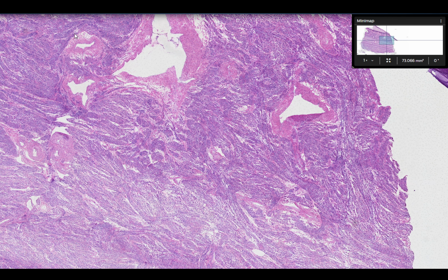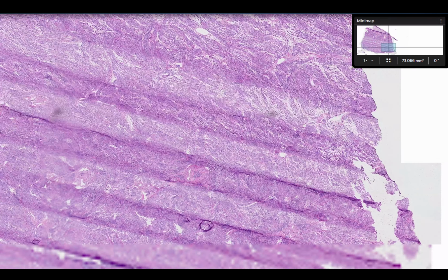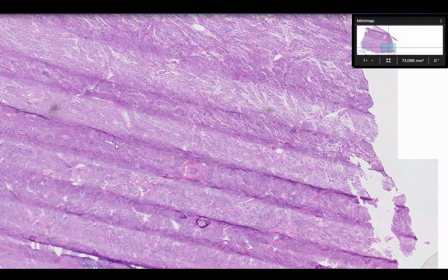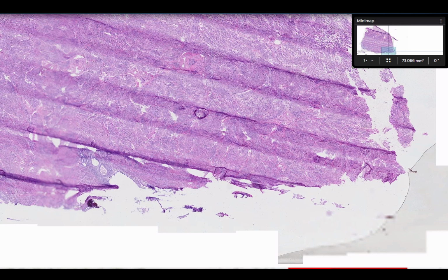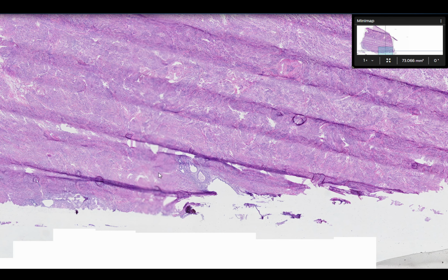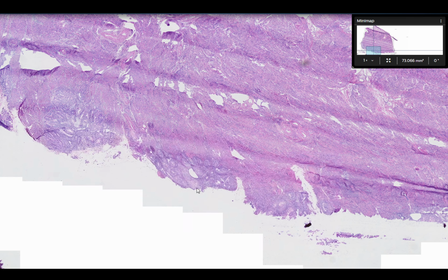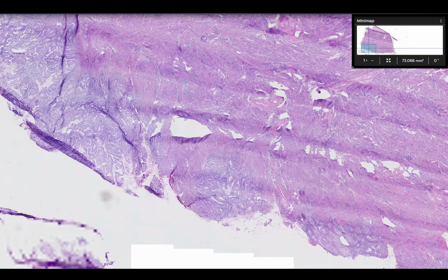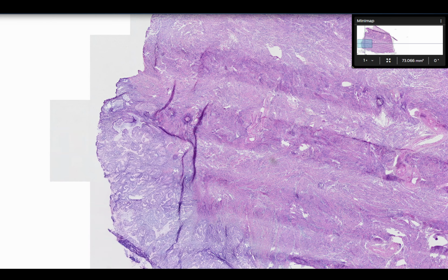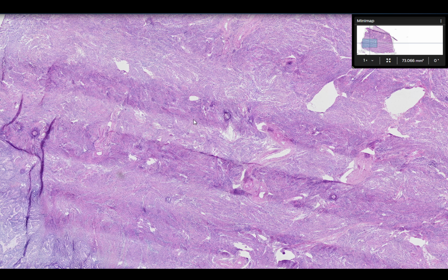There's also some arteries here. And let's go here. This is some frozen blade artifact. Here's another artery. Here's some sort of surface or some sort of glandular material, and more glands. And then here is some more different interesting things. So let's just zoom in.